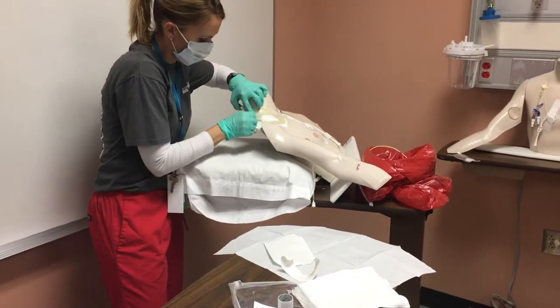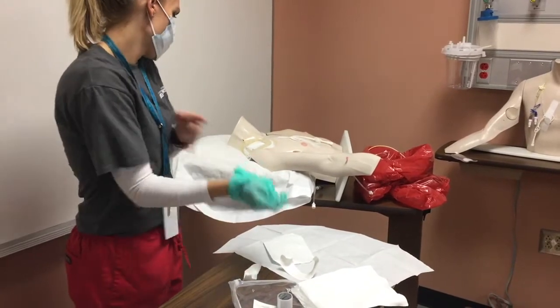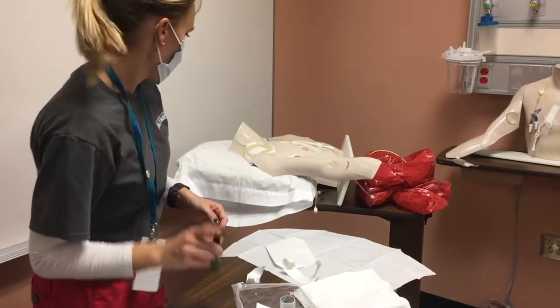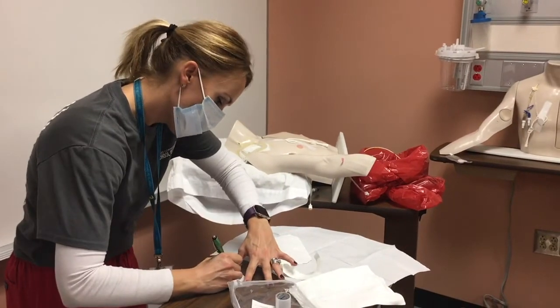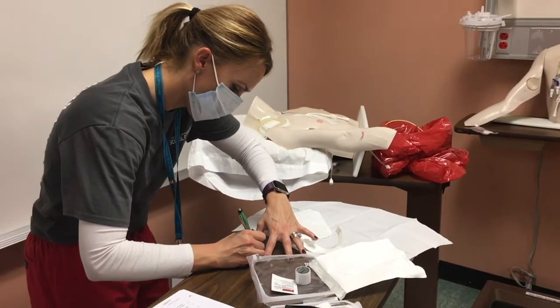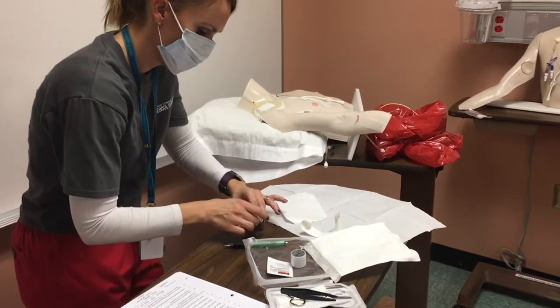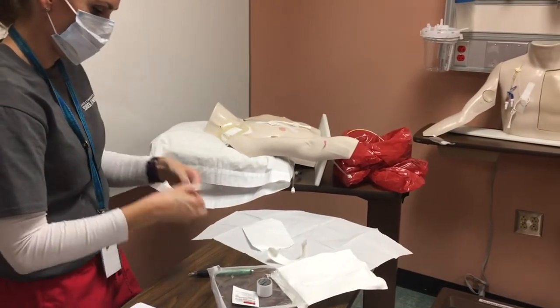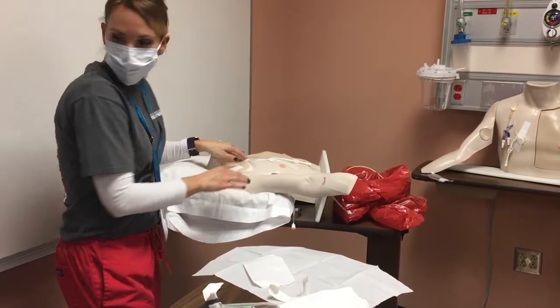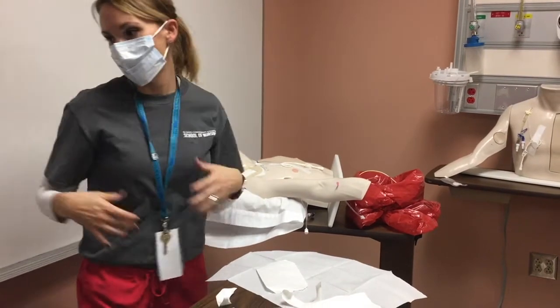You're going to use the label here. Date it — we'll say it's 10 o'clock — and put it along the bottom there. Then you have to measure the complete catheter at the very end.